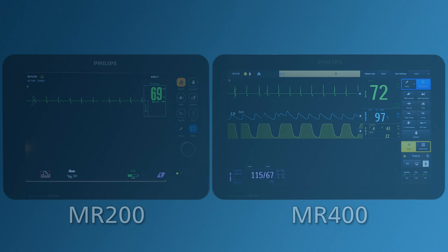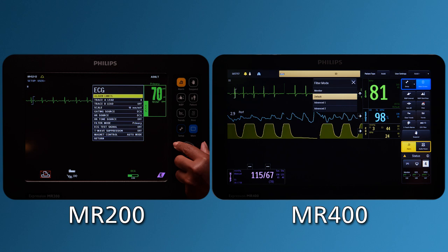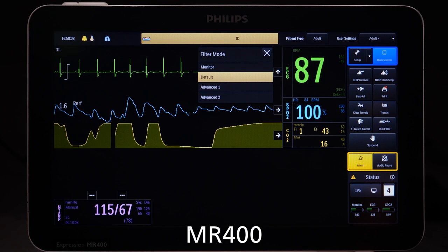If you start your scan and you begin to get artifact due to certain MR sequences, you can change the filter to help reduce artifact. The MR200 and the MR400 have filter modes that are designed to remove gradient artifact generated by the MR system. There are four available filter options for the MR400. Default filter is the monitor's default filter and provides the best performance on most MR sequences.